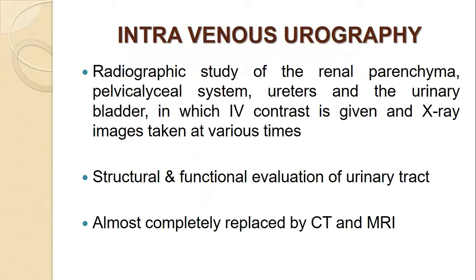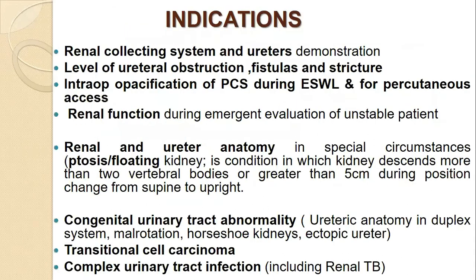So the first one is intravenous urography. It's a radiographic study of the renal parenchyma, pelvicalyceal system, ureters, and the bladder, in which IV contrast is given and X-ray images are taken at various times. It shows structural and functional evaluation of the urinary tract. It's nowadays almost completely replaced by CT and MRI.